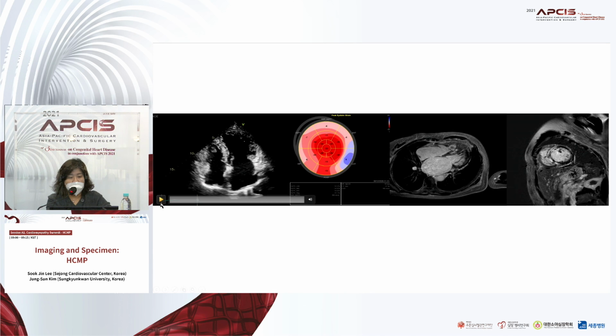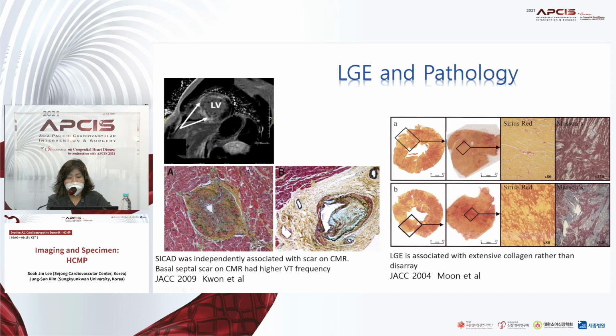And in another case, a 55-year-old female had a decreased LV systolic function. The LVH was not that severe, but she had an asymmetric septal hypertrophy and late gadolinium enhancement in septum diffusely.